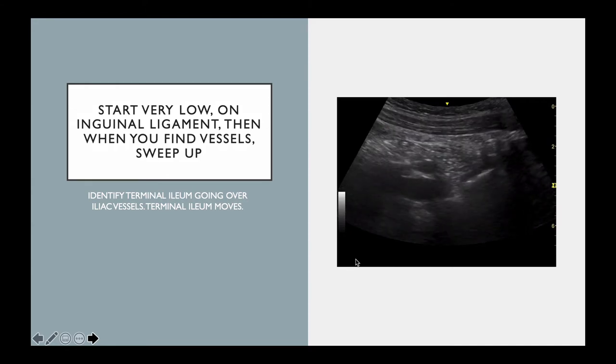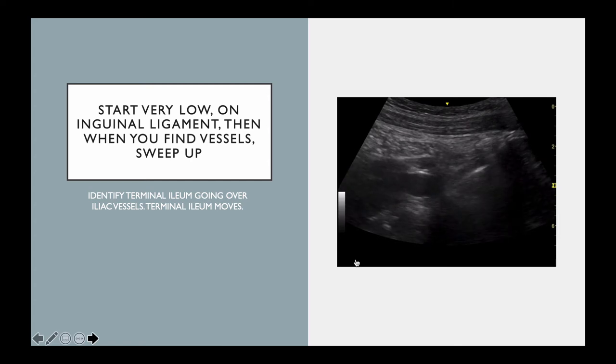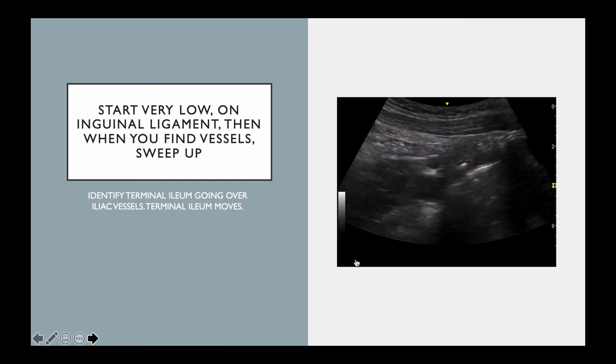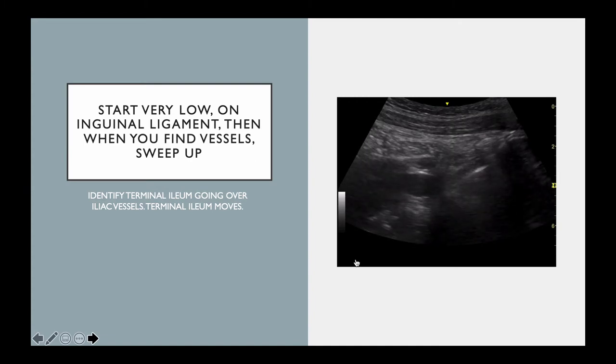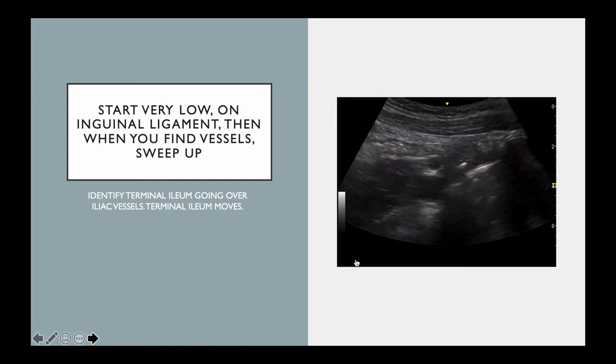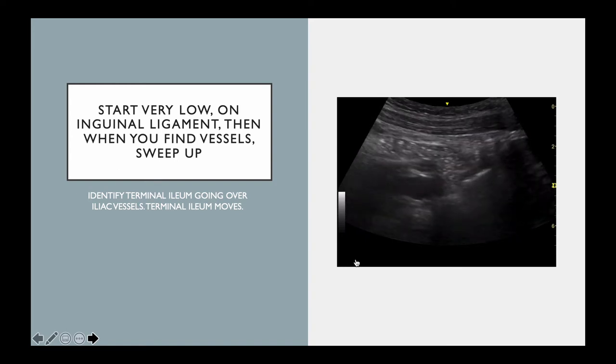And once we find those iliac vessels, we slide just a little bit rostrally towards the head until we see the first bit of bowel crossing across in front of them. Now, this is terminal ileum, and that's a very important handhold for us. Terminal ileum is often peristaltic, should move quite a bit.